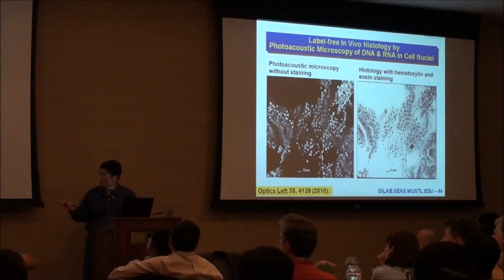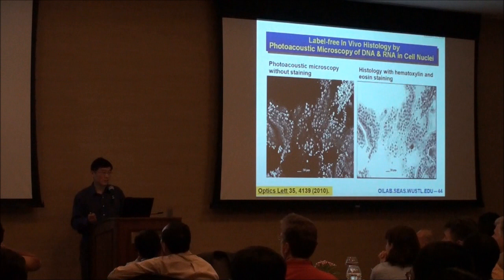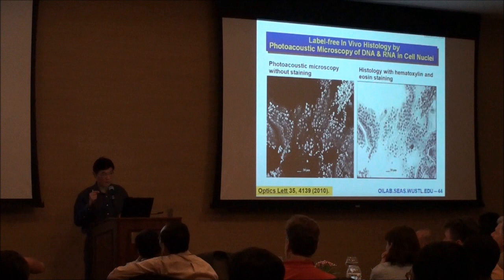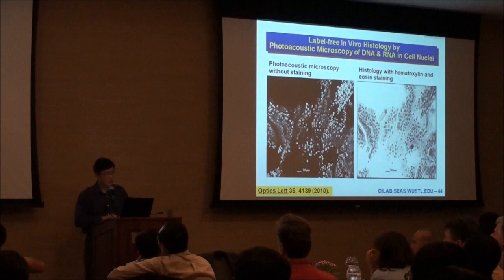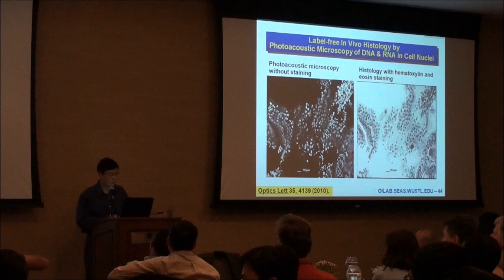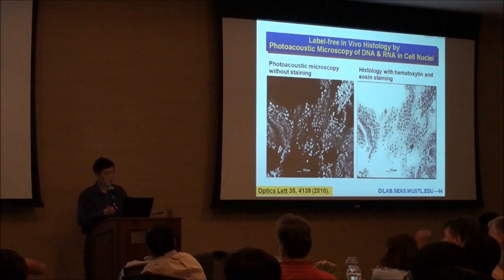And one of the initial applications we're thinking about is Mohs surgery, and that's for skin cancer removal. The surgeons have to remove whatever is visible. You know, when there's a skin cancer, the bulk of the cancer is visible. There is pigmentation going on. And then there's some other cancer cells that are invisible to the naked eye. You have to cut a tissue, send it to pathology. If the pathologist says it's all clear, then you're done with the surgery. If the pathologist says, no, there are still cancer cells, you gotta cut more.